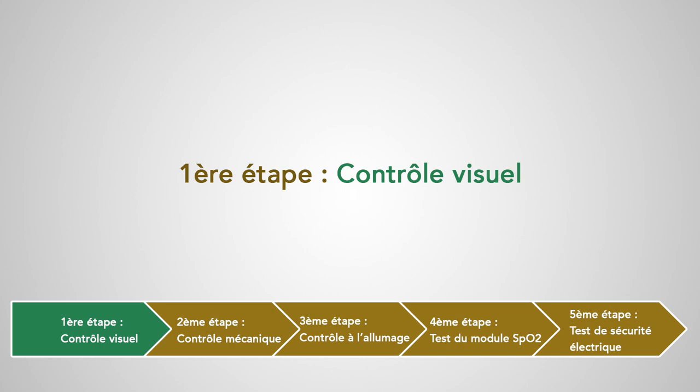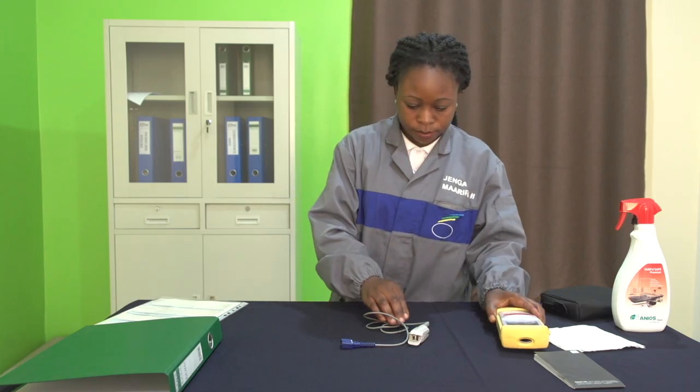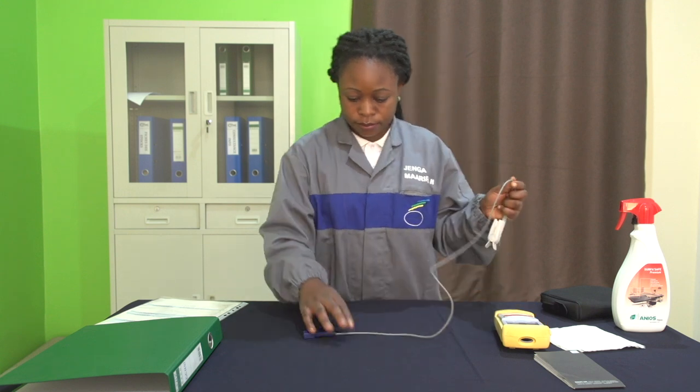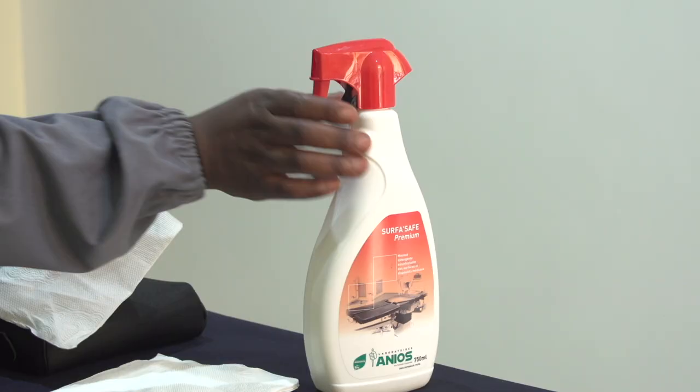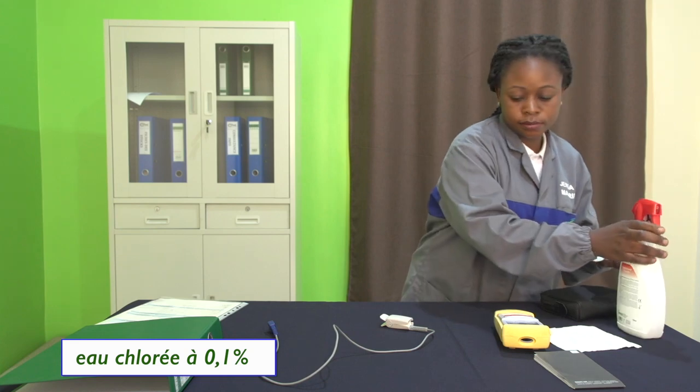Première étape : contrôle visuel. Nous allons vérifier la propreté de l'équipement et la présence de tous les câbles et accessoires. On commence par nettoyer l'appareil avec un produit détergent désinfectant approprié aux dispositifs médicaux ou avec de l'eau chlorée à 0,1%.